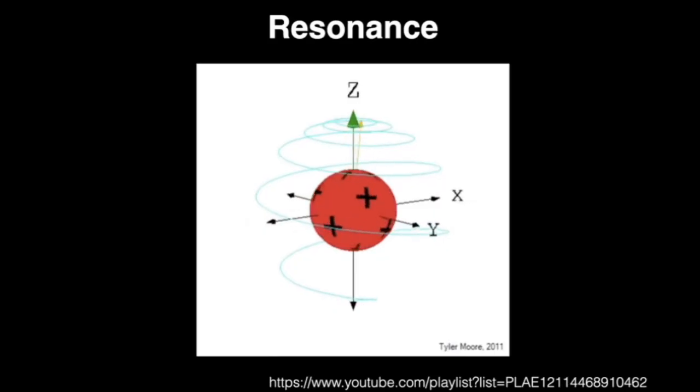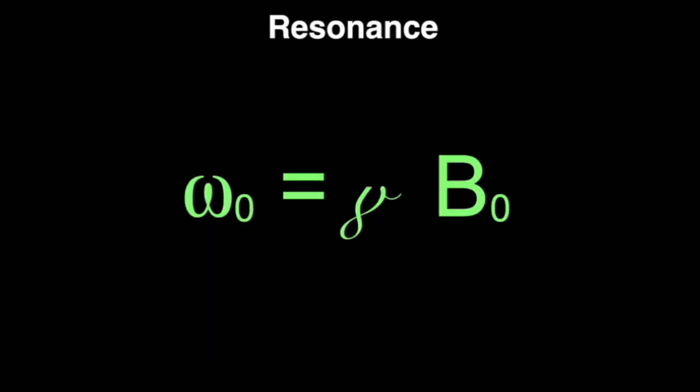So when your subject or sample is in the MRI scanner, they become weak magnets in the system. This is what is happening as part of that magnetization. The hydrogen nuclei are now precessing around the main magnetic field, and there is a simple equation that links the frequency at which they precess around that field, omega zero.